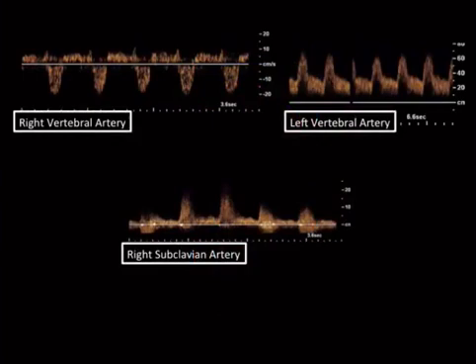So here we go. Here is a classic. Anytime you see vertebral artery in a Doppler question on multiple choice, there's only one answer. And it's this. It's subclavian steal. And you've got reversal here. But without even seeing that, you know that when I say vertebral artery Doppler, you say subclavian steal. That's the only thing that they're possibly going to show. I say vertebral artery Doppler, you say subclavian steal.